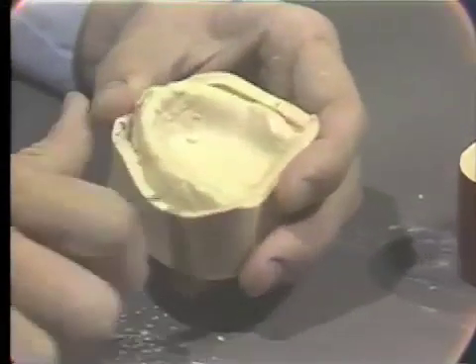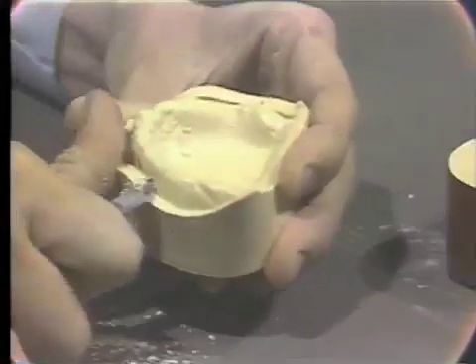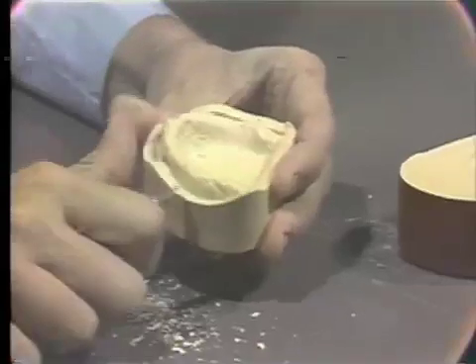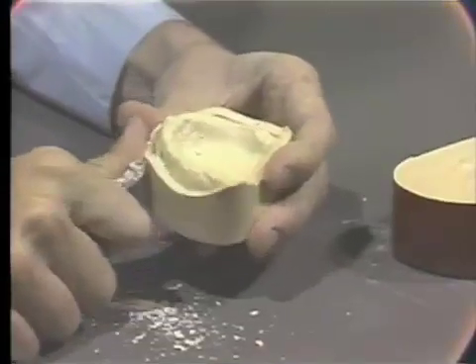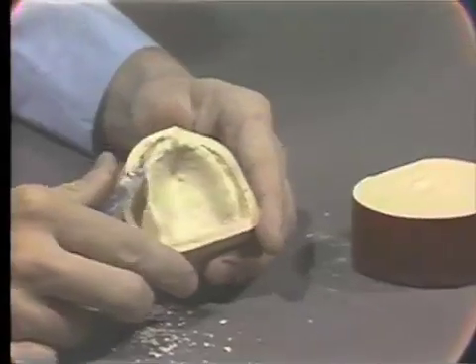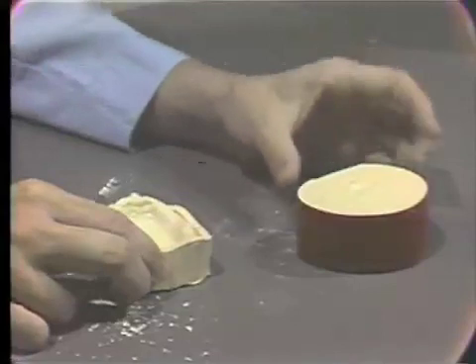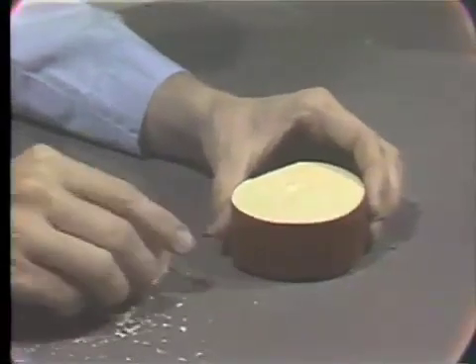The first step is to freshen the boxing edge with the sharp edge of our laboratory knife. The final preparation of the maxillary master cast will take place on the model table. But before doing that, let's separate the mandibular master cast.